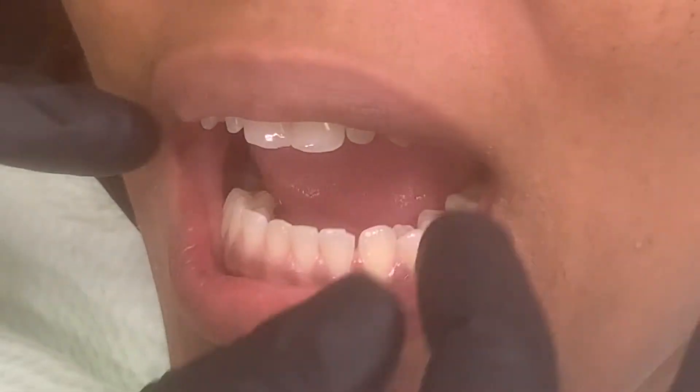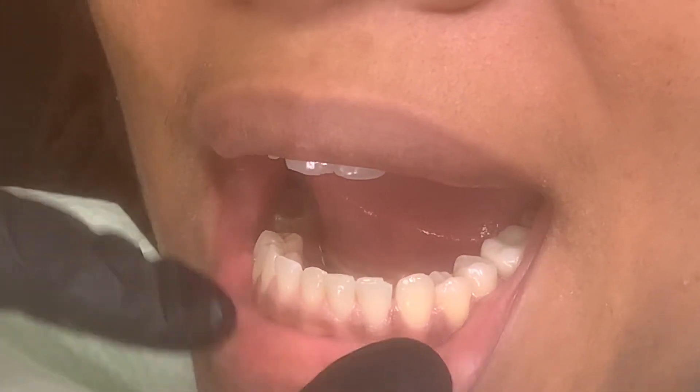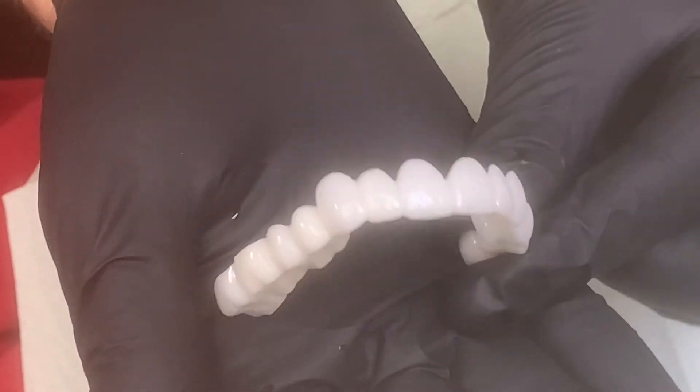So everybody's going with snap-on, and we didn't do anything to her lower teeth. Her lower teeth are very straight and nice. So you're not going to believe this. This case looks so great — it is gorgeous, I can't wait to place it in.